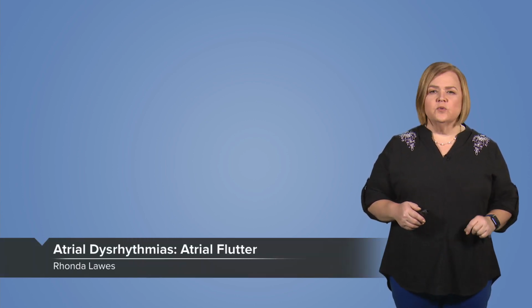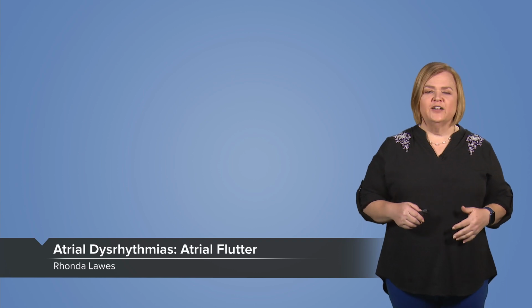Hi, welcome to our video series on electrocardiograms. In this one, we're going to specifically discuss an atrial dysrhythmia known as atrial flutter.